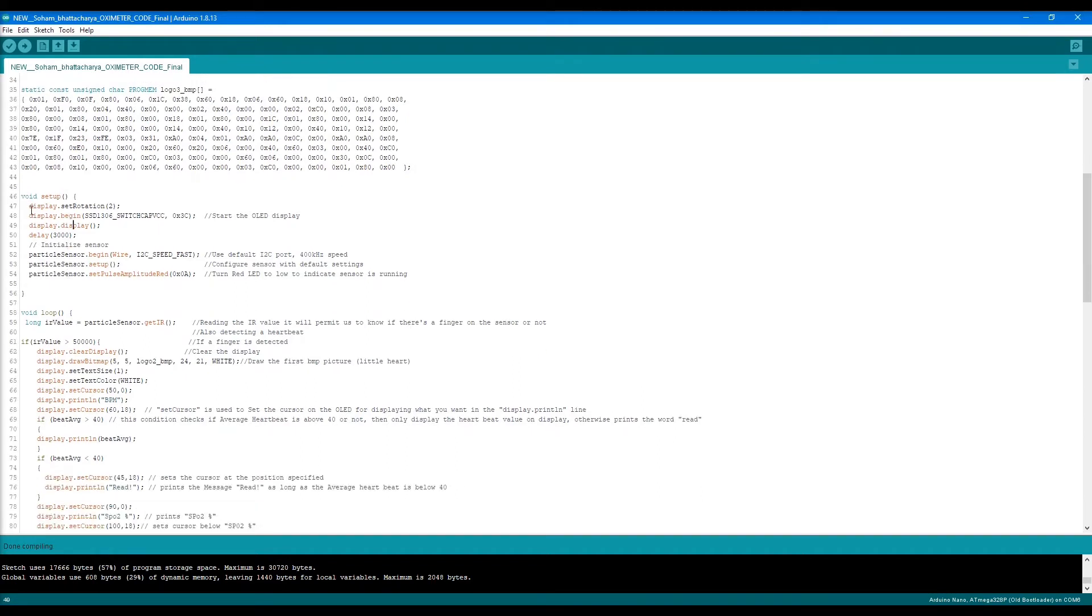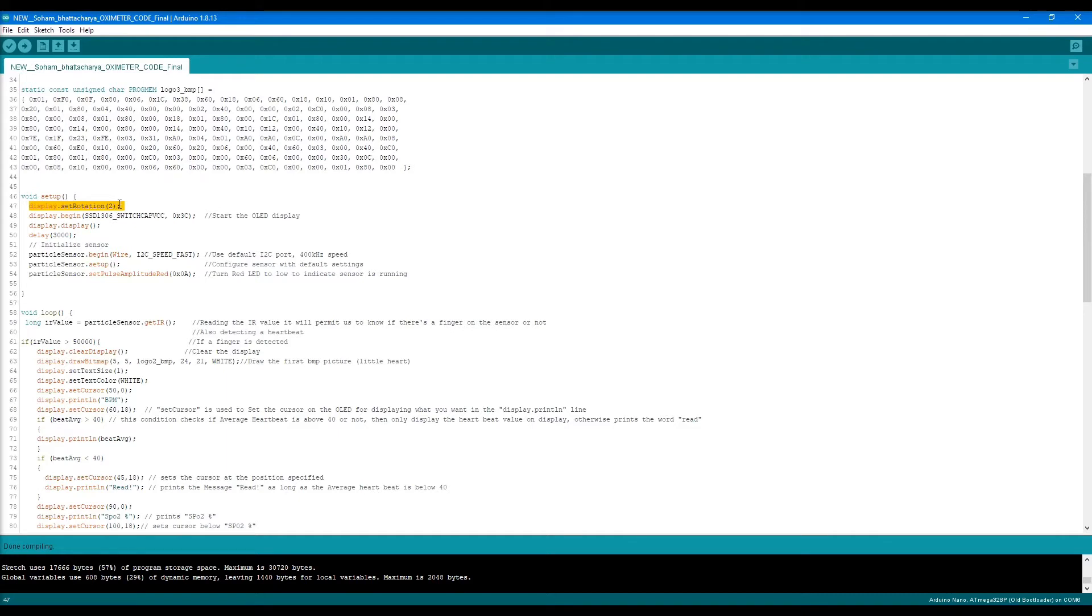Next we come to line 46 where we do the setup process. In this line, I have set the rotation of the display because I accidentally hot-glued it in the opposite direction, so I rotated the display. You can do it with this. Next we start the OLED display with this code.